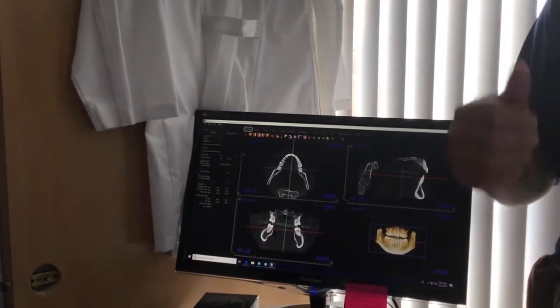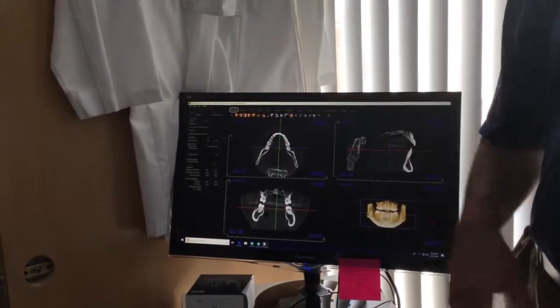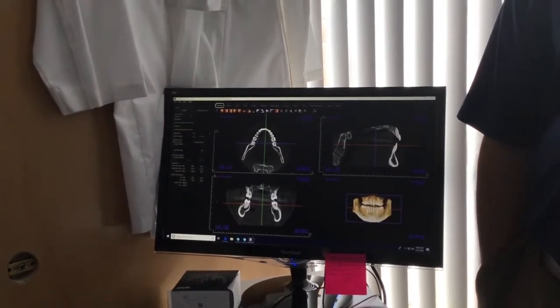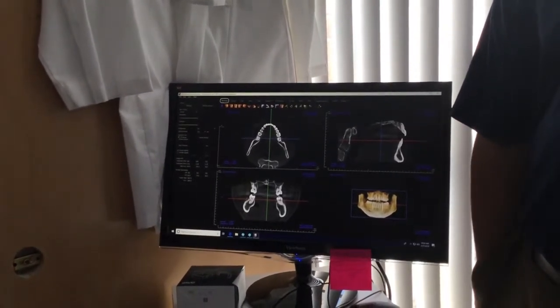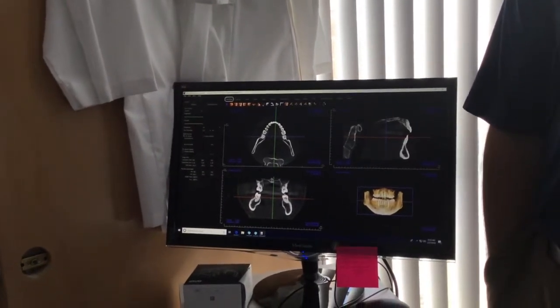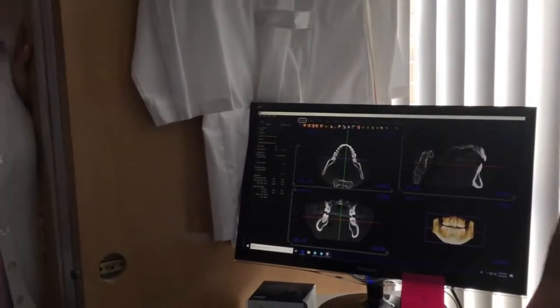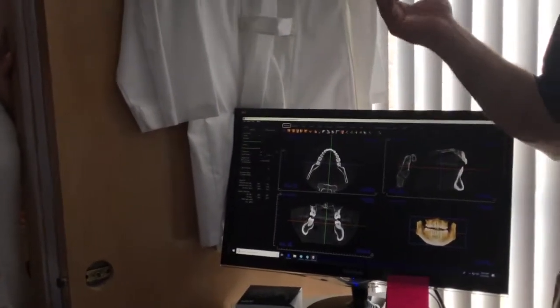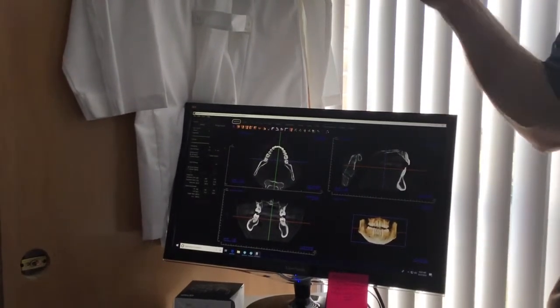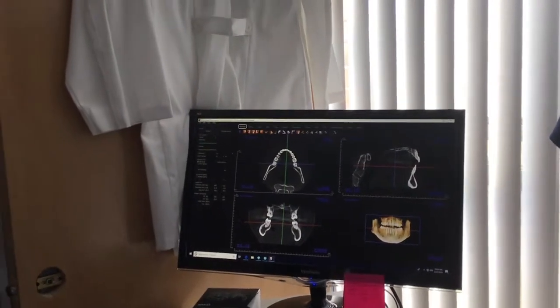So you can put it on that. The day the tech comes to do this, if you bring your laptop in, he can do it for you. This computer now, is it on Wi-Fi or do I have to cable it? The file transfer will be slow, but once it's there, it's not a big deal. As long as it can read your network, it should be fine. It'll take a little longer to transfer the file over originally, but once it's open, it's on your computer and local. That makes sense. Let's cable it.